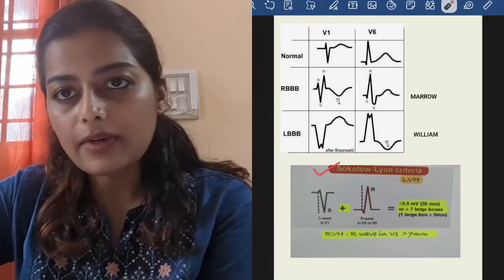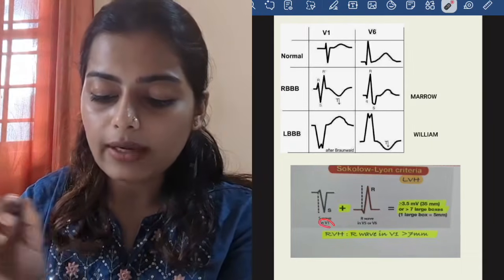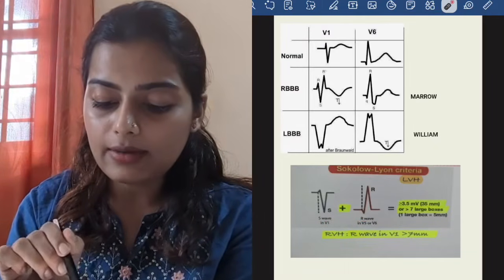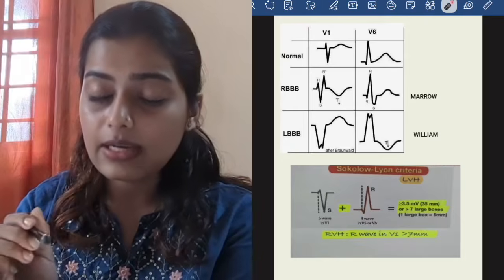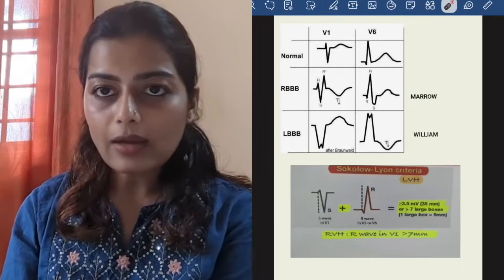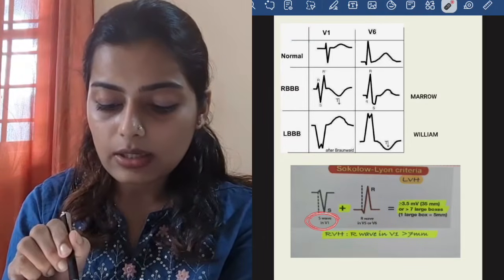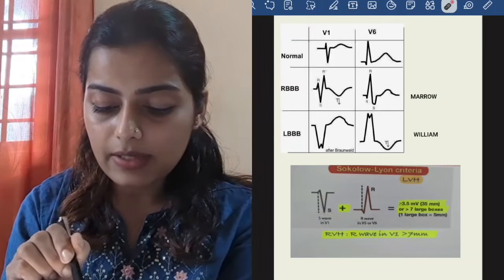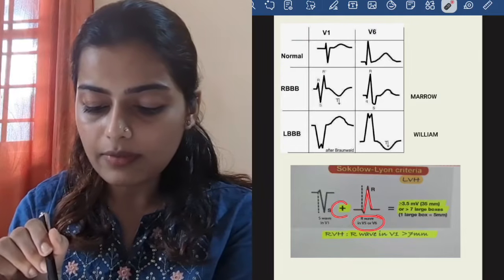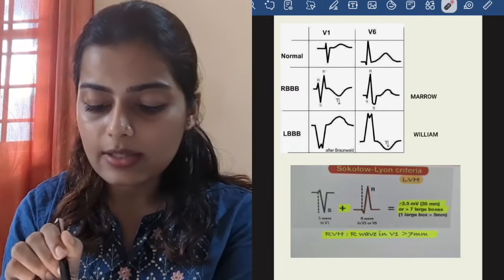Okay. Next, I'm going to discuss how to diagnose whether the patient has left ventricular hypertrophy. For that, we have several types of formulas. The most important thing that I am going to discuss is Sokolov-Lyon criteria. In this, we should take the leads again V1 and V6. We can take V5 also, V5 or V6 and V1. To calculate if the patient has left ventricular hypertrophy, we should take the S wave in V1, that is that negative wave, S wave in V1. And we should take R wave in V5 or V6 and we should add these two together.